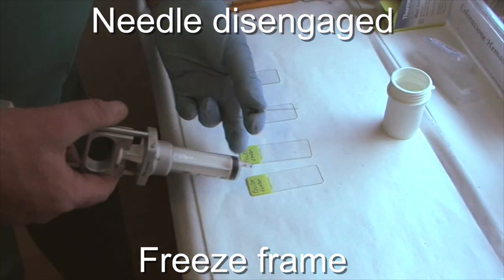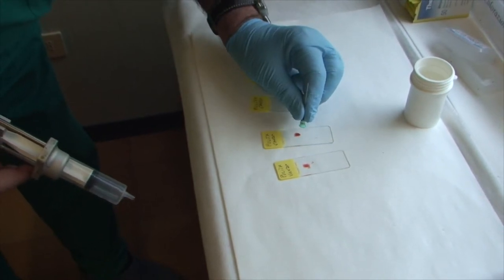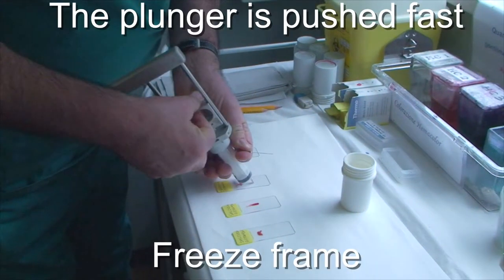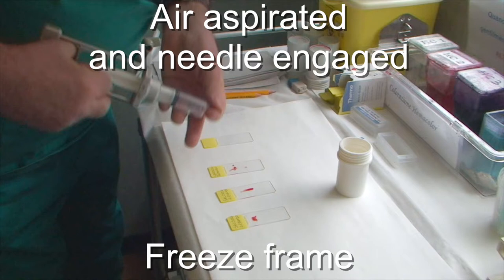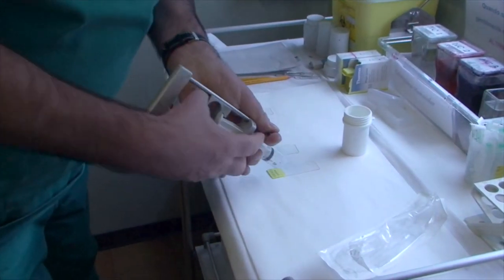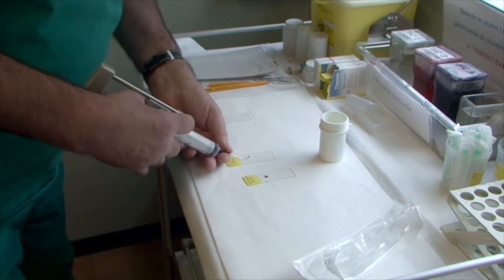If sampling was carried out through aspiration, the needle is disconnected from the syringe temporarily. At that moment, there is some specimen within the needle and some in the main body of the syringe. First, the operator drops the specimen through the back hole of the needle onto the slide. Then, he aspirates five to ten milliliters of air into the syringe and splashes the specimen still in the syringe over the slide by fast pushing the plunger. Secondly, a further five to ten milliliters of air is aspirated into the syringe. The needle is engaged again and the plunger pushed down, so any specimen still left within the needle splashes over the slide. Whenever there is more specimen inside the main body of the syringe, the cycle is repeated over another new slide.